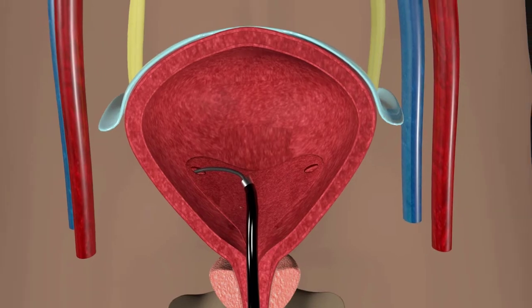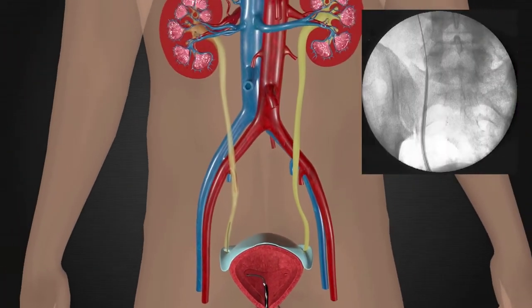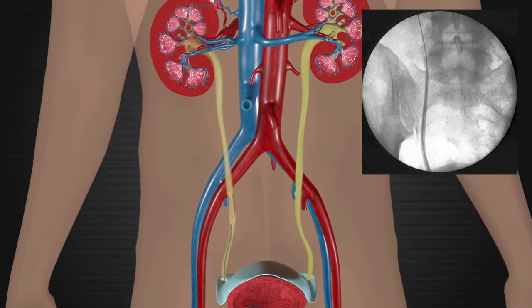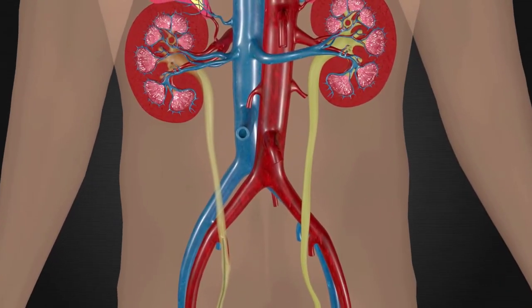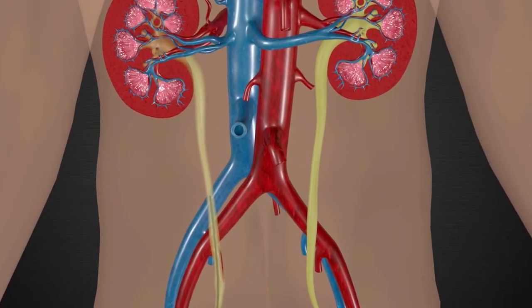Once we have found it, we will place the wire into the opening and use X-ray to watch as we advance it to the level of the kidney where the urine first collects. Once we have all wires in place, we are then able to advance our sheaths, which provide a safe working channel for our instruments, protecting your ureter from our equipment.